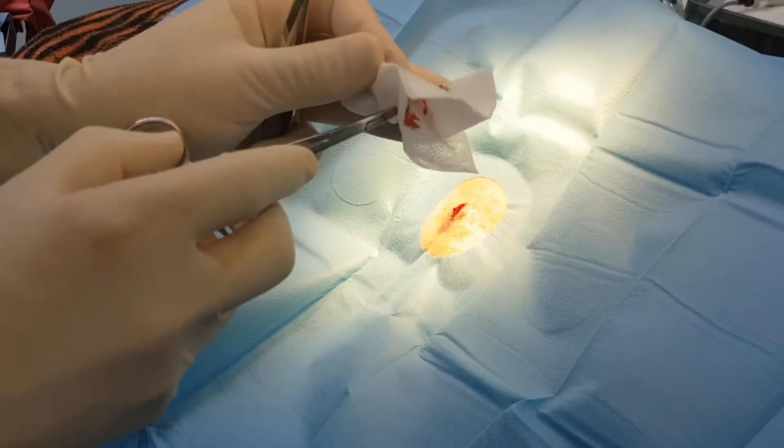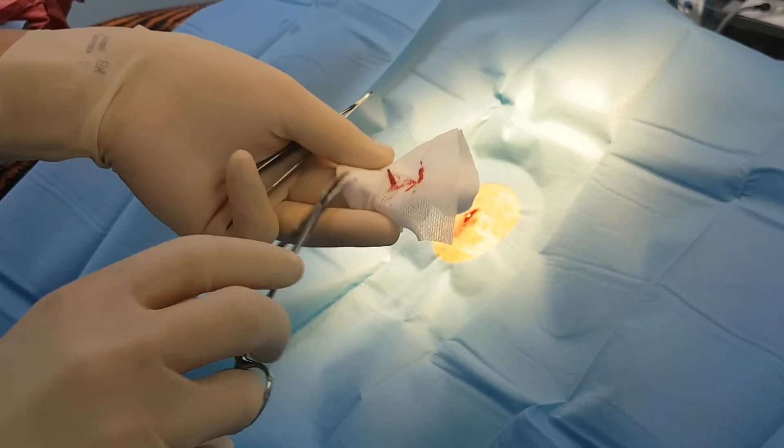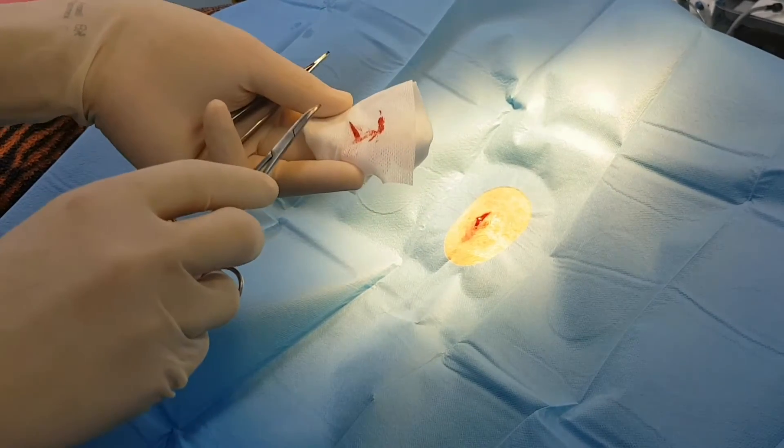That one was continuing to migrate, so left alone it was going to keep going under the skin and causing problems. We'll give that a good clean out now and we'll stitch it up.